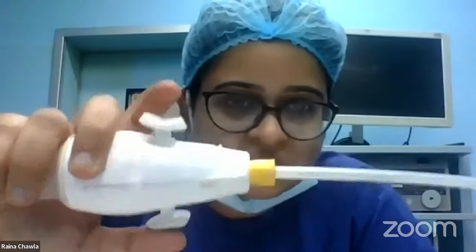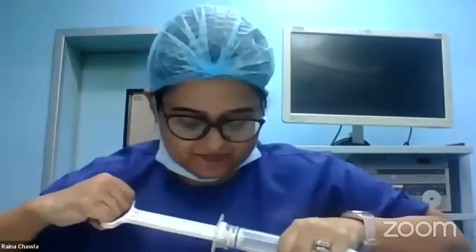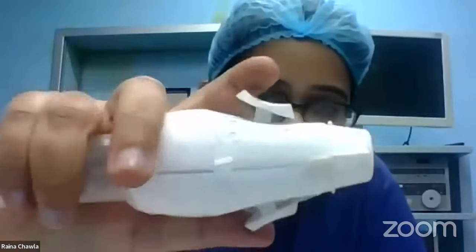Did you hear that swoosh sound? I'll do it again for those who didn't hear. So that release of pressure will cause suctioning of all the products of conception. Did you hear that? So that is release of pressure, and everything gets suctioned inside here.